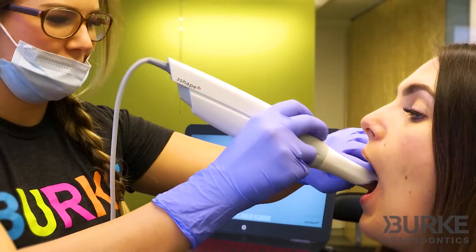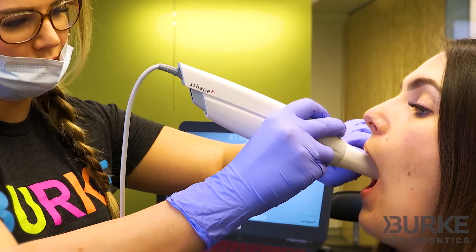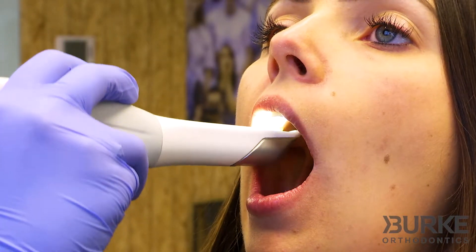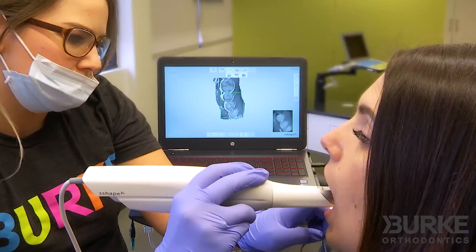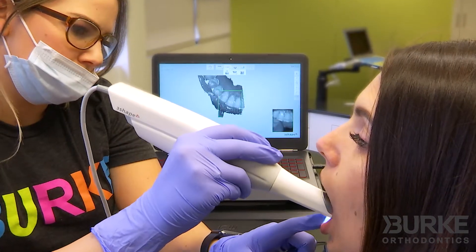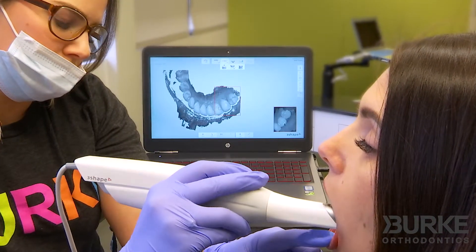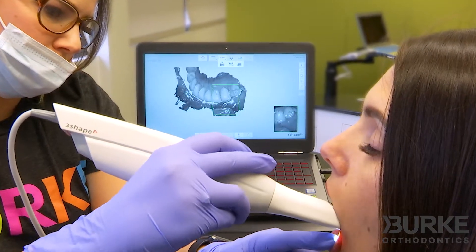The digital scan is done using a wand with a small camera on the tip. The orthodontic assistant places the wand inside the patient's mouth and moves it around to capture a 3D image of the teeth. As the image is acquired, it shows up on the computer screen so the assistant can ensure all necessary anatomical structures are obtained.